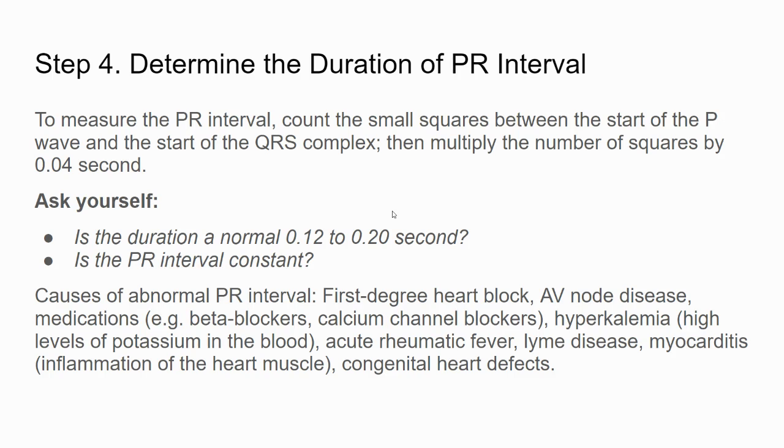Okay, there's different types of heart blocks where you can have an increasing PR interval, or you can have other PR intervals that are just delayed, which is prolonged, which would be something in your first degree heart block. Then you can have things like a second degree heart block where you can get longer and longer and longer until it just drops a beat. Okay, these are all things that you're going to learn more in Med-Emerge. But again, now we're just looking at what are the steps and what are the criteria that we're looking at.